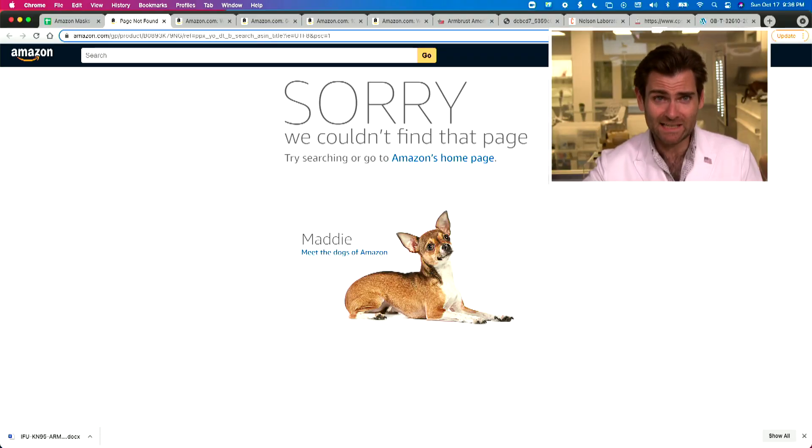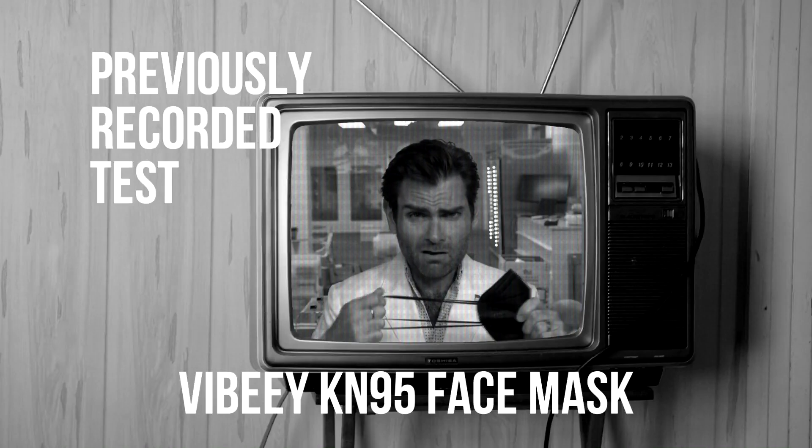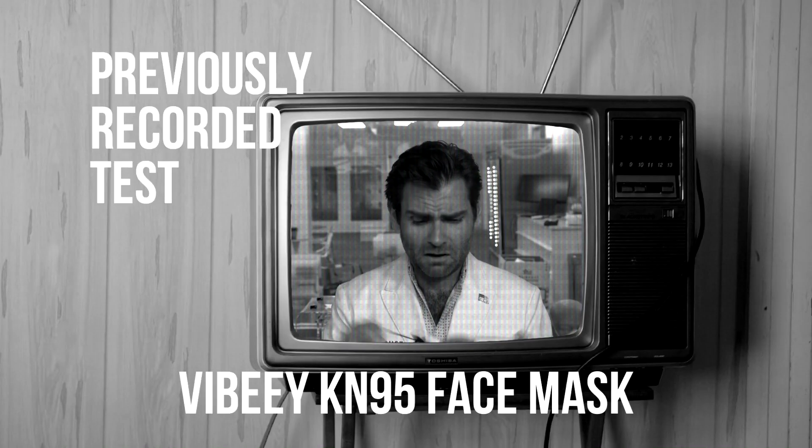Hey everyone, welcome back. We're testing every single mask on Amazon, even the ones that we bought and then got kicked off Amazon before we could review them. This is the Vibee mask — they are also making KN95s and we just reviewed them as well. Let's get it in the clamper and see what happens.